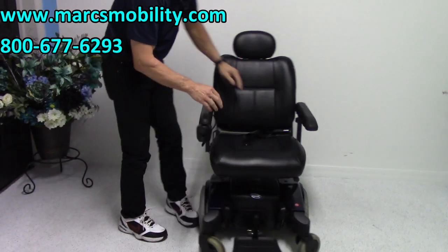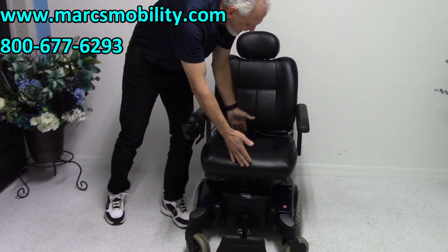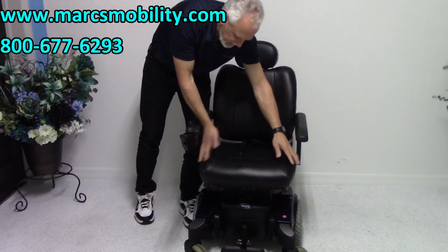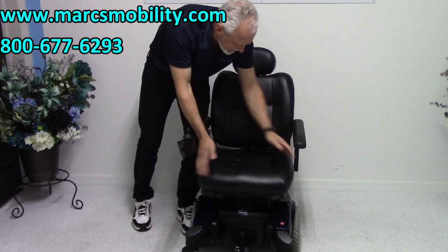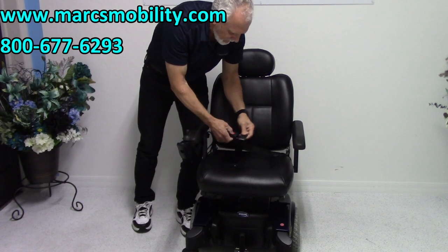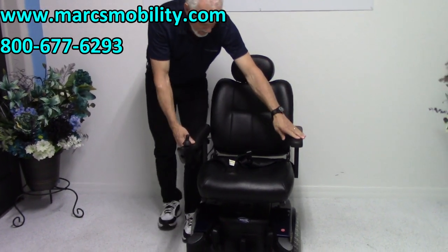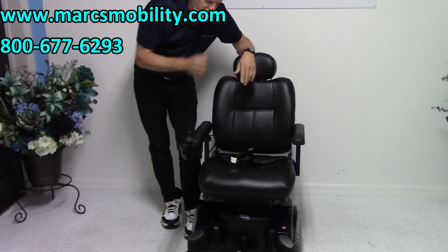The seat on this chair is 19 by 19. It's a vinyl — it looks like leather and feels like leather, but it's not. Most of these chairs are vinyl, 19 by 19. You've got a really nice safety belt. The arms do flip up, and they also go out if you need more width.